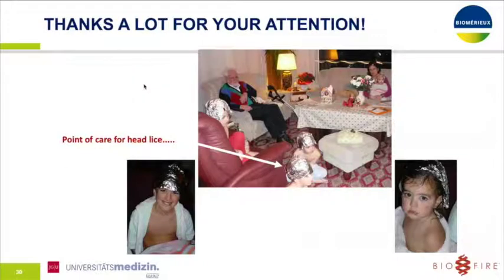Right. Thank you. The other question is, do you know approximately what was the positivity rate that you got from the lab before you implemented the GI panel at your point of care setting? So the rate of positive findings is a little bit difficult to compare, because before we had the GI panel, we had 3 different departments that we had to send the samples to.